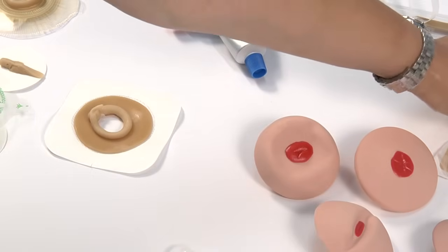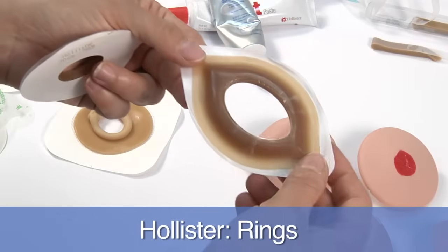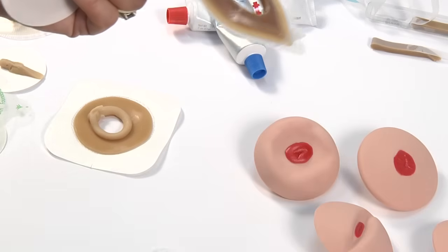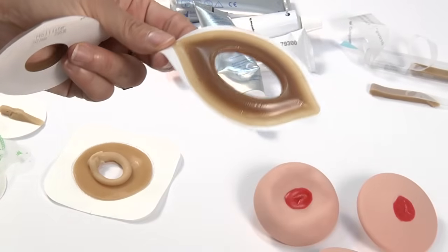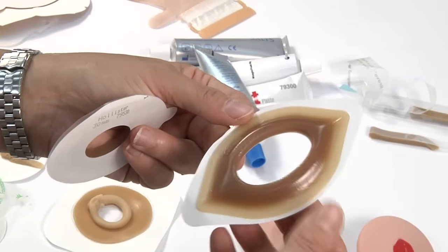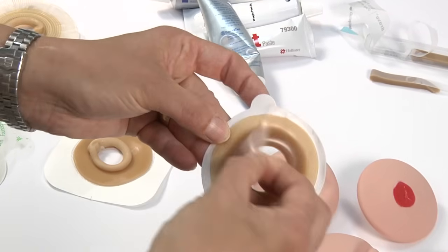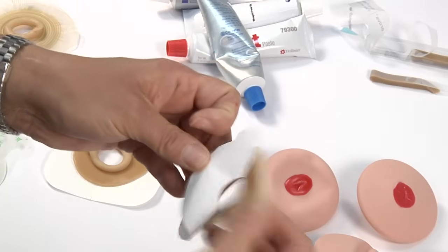There are other rings that are available, and these ones are from Hollister. These are their convex barrier rings, and these are the only ones that are available. All barrier rings will actually add some degree of convexity, but these are far more pronounced. As you can see from the side, you've got quite an elevation and a tapered edge. They originally came out as this shape right here, which is the round one, and they have 3 different sizes.